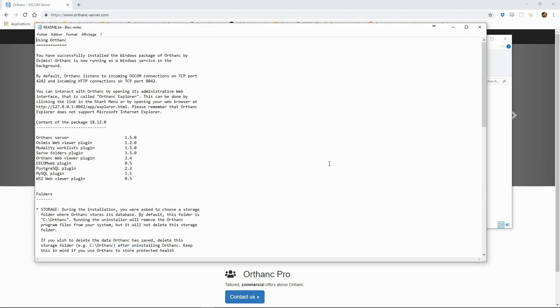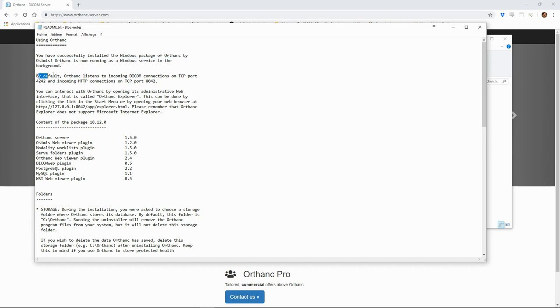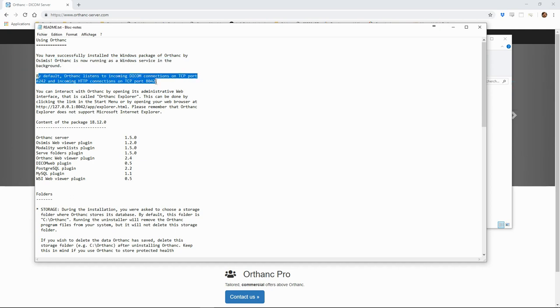Once installed, Orthanc runs as a service, meaning that it can run continuously in the background and will respond to requests on certain ports. It will typically listen on two ports, one for the incoming DICOM connections and one for incoming HTTP connections for the web interface.